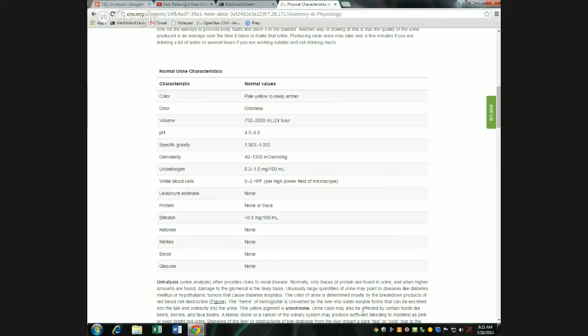So go ahead and get the tubes and the dipsticks and your samples. Oh, I forgot to say this. Don't get rid of your cup just yet. We need that for cleanup later on, which I'll explain after sedimentation. So just do what I tell you so far.